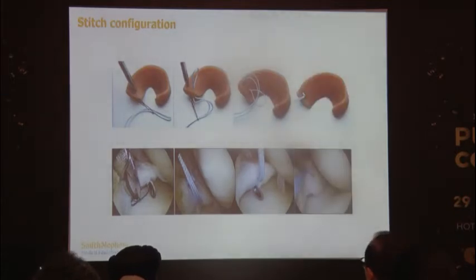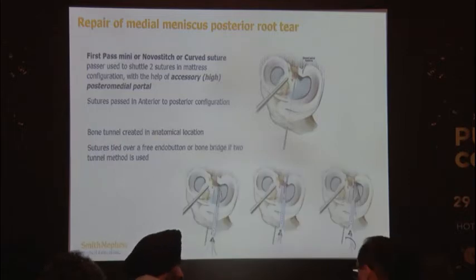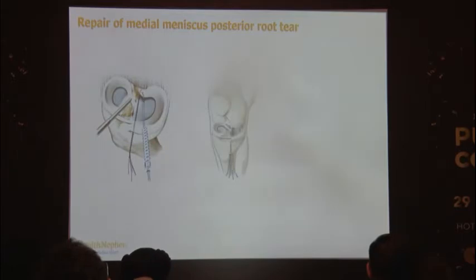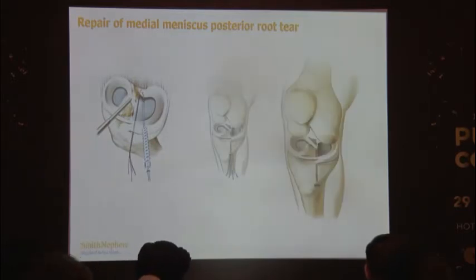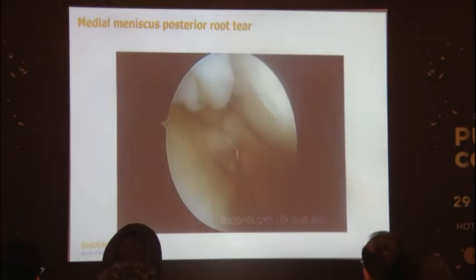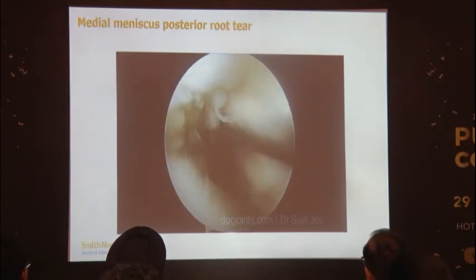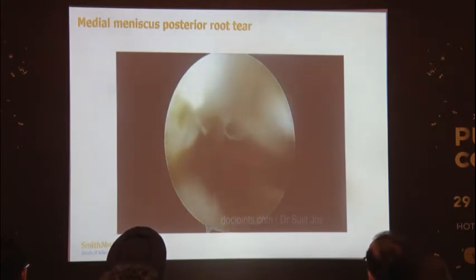Stitches are placed with an indirect suture-passing device or a direct device, or using no-suture instruments as demonstrated. The bone tunnel must be in the anatomical location, and pull-through sutures are placed to keep the root in position. In this video of the medial meniscus posterior root, we can see it is detached from the medial side, and the cartilage is good on both the femoral and tibial plateau sides.